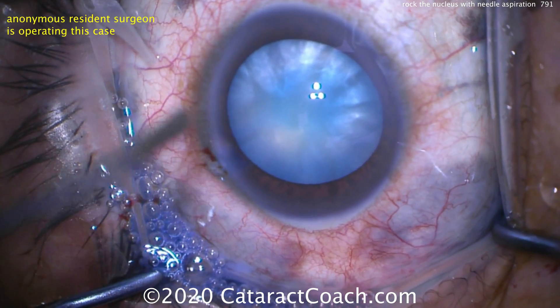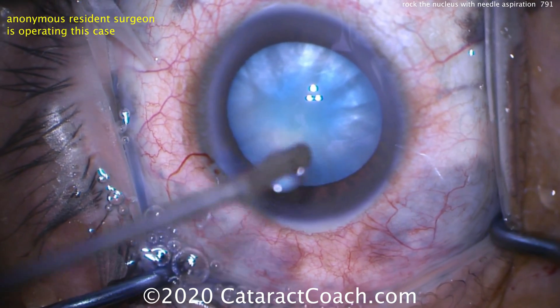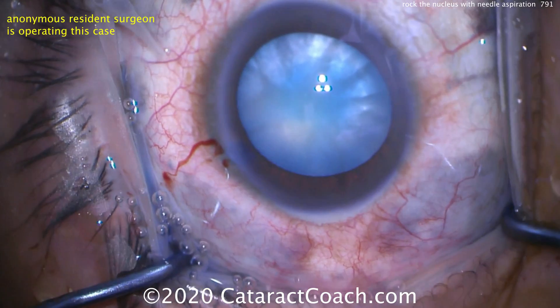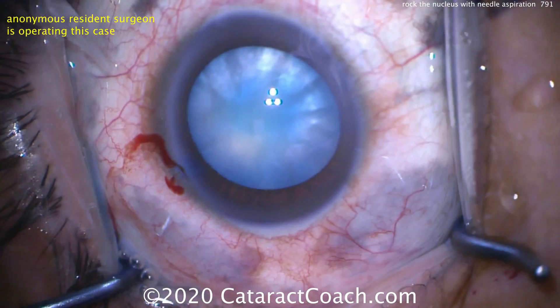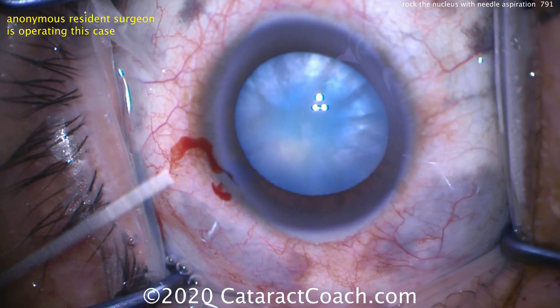You can judge that by touching the cornea. Now what we're going to do is switch over and get a sharp 27-gauge needle on a 3cc syringe, which is about half filled with balanced salt solution. That needle can also be slightly bent for easier access — just make sure that it still flows normally.